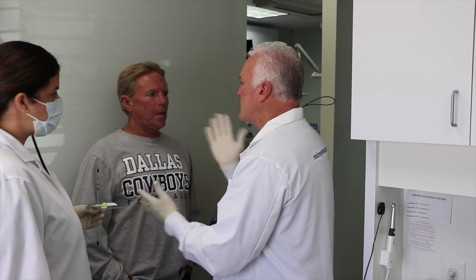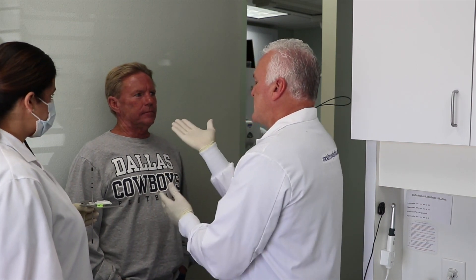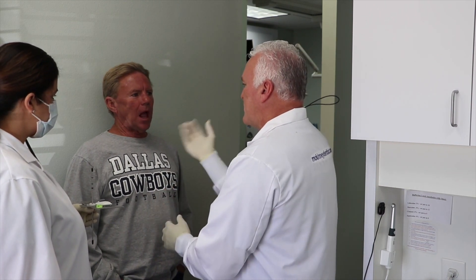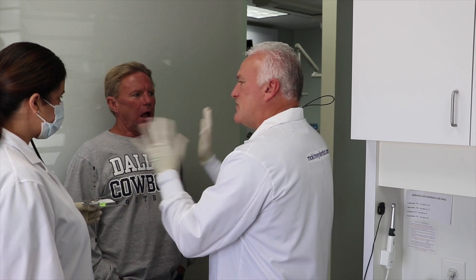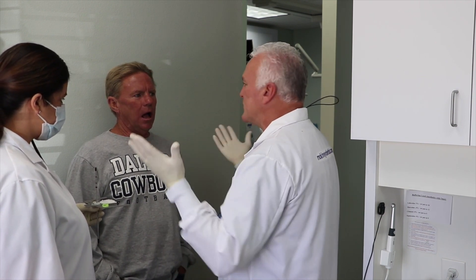Brad, what I need you to do is just stand still. We're going to hold it in place — I'm just going to hold it right there. Your mouth is going to stay open about that far, and I'm going to hold this here while we move some things around. It takes about 30 seconds to set up and then we're done.